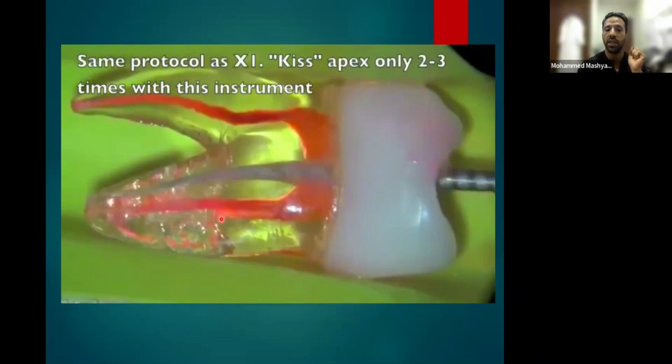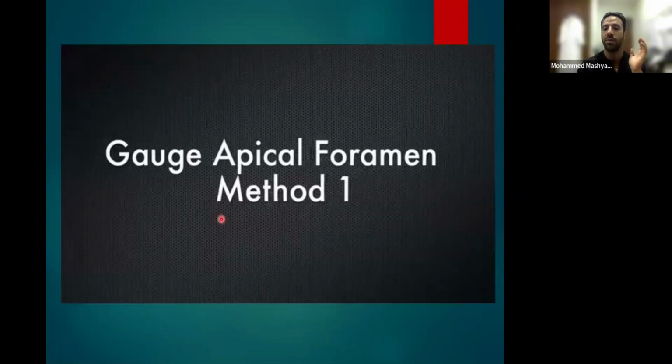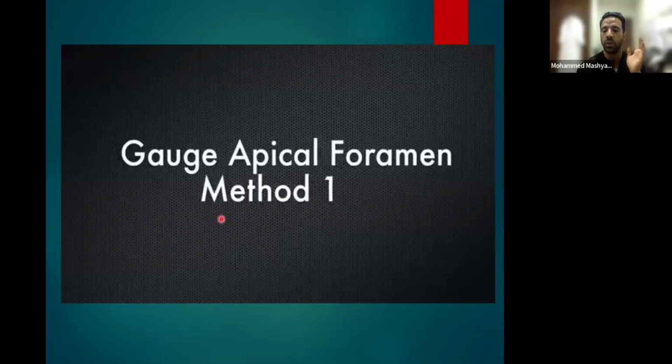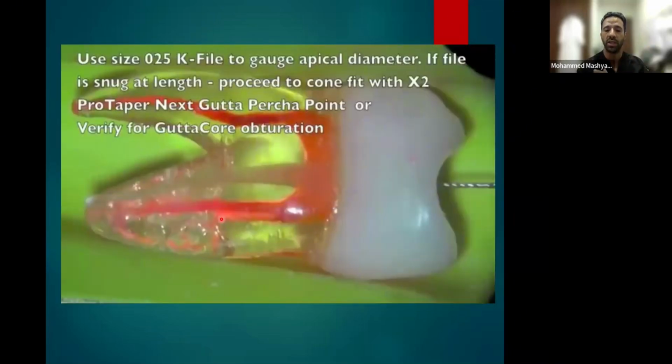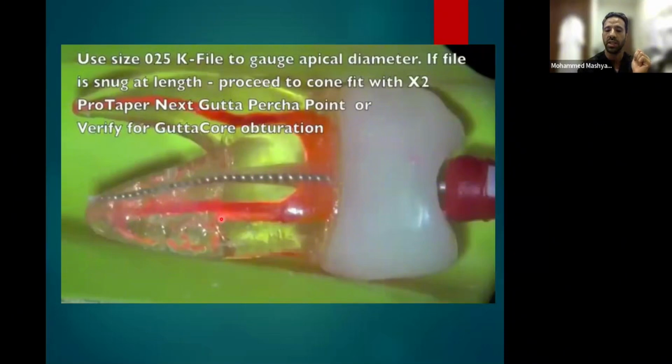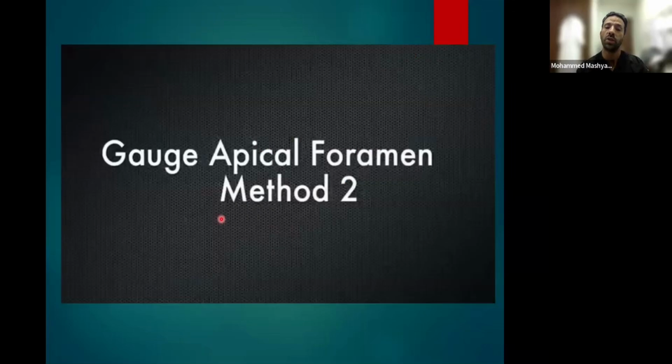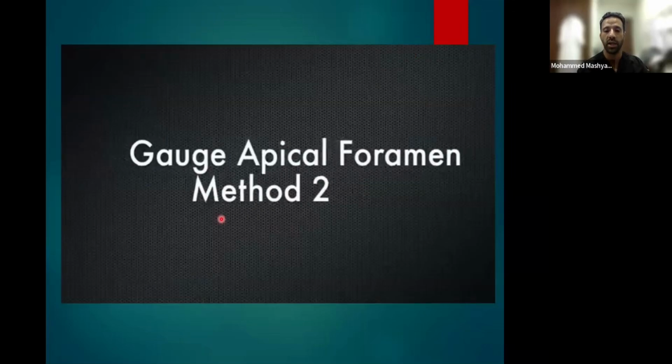Tell him, show me the difference between 04 taper and 06 taper and variable tapers, okay? But the most famous ones are 04 taper and 06 taper. That's very famous everywhere. Whoever used the ProTaper system before knows it's a bigger taper actually, 07, 08, 09. So use it for a bigger canal. Don't use it for small and curvy canals.